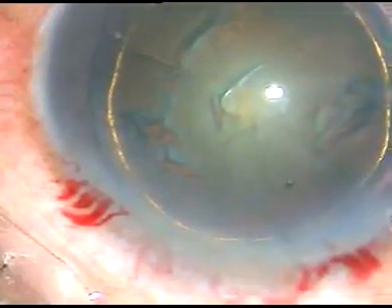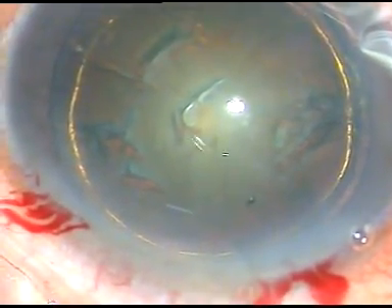Dispersive viscoelastic substance is again used. Now is the time to enter into the eye with the tip of the FACO handpiece. Here it is. This is the Oertly Catarix III FACO machine.